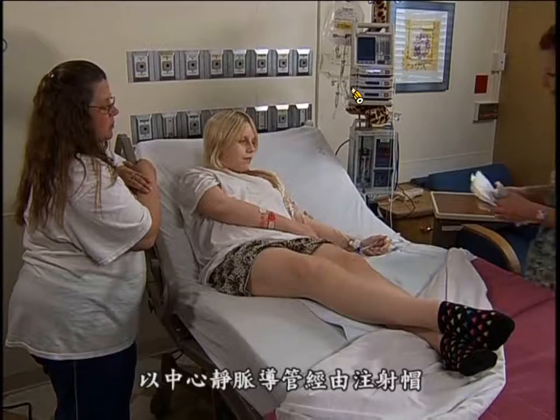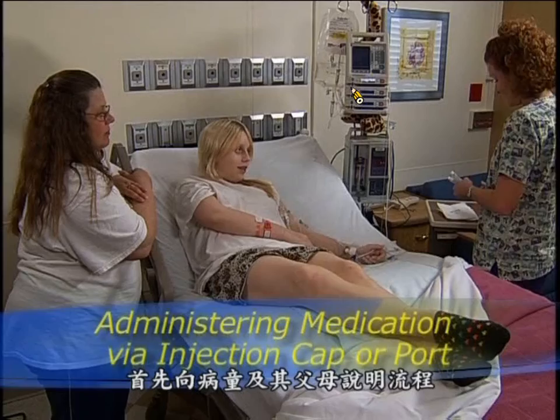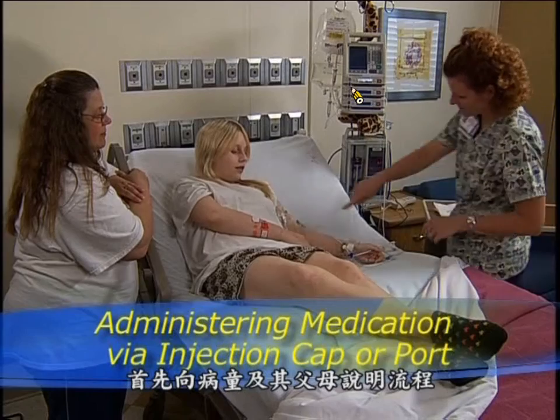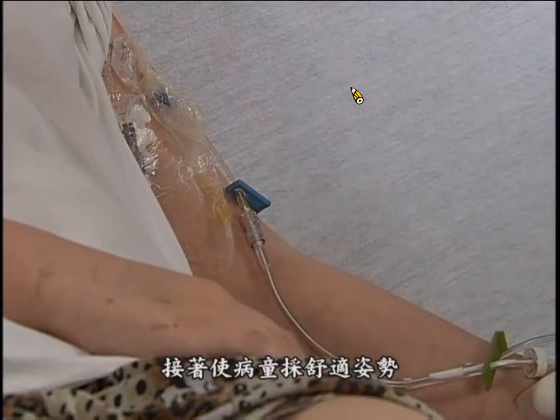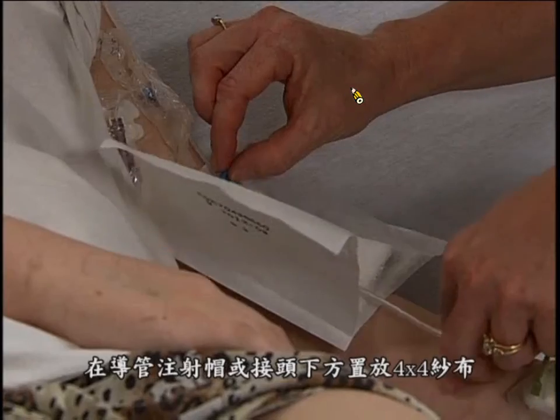Access a central venous catheter for administering medication through an injection cap or port. First, explain the procedure to the child and parent. Then, with the child positioned comfortably, place a 4x4 gauze pad under the catheter cap or port.